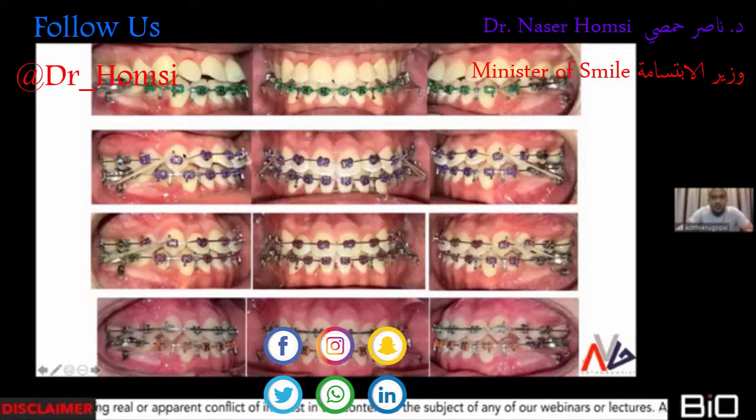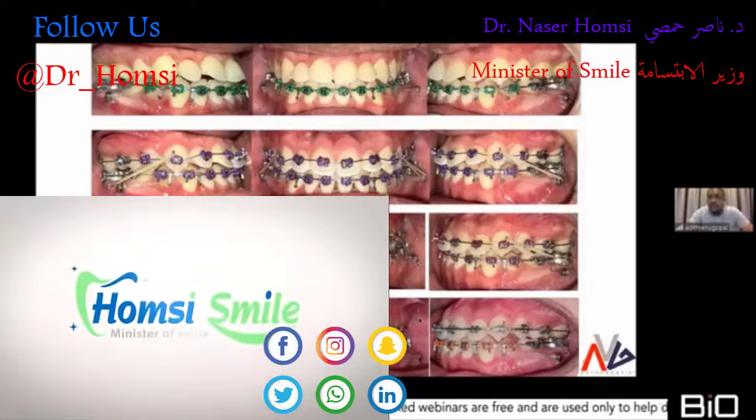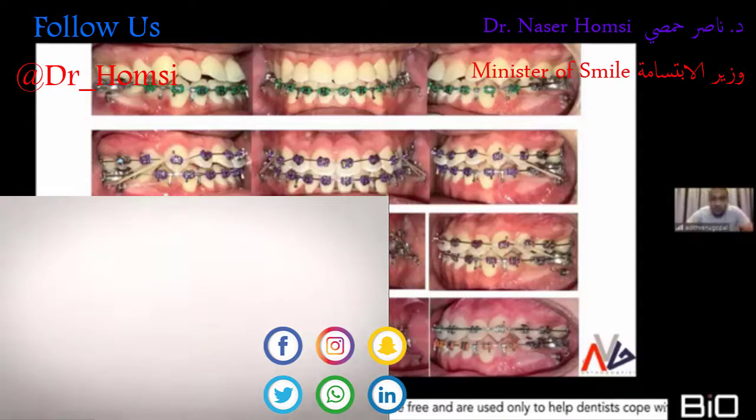If I would have used the elastics from the upper canines onto the lower molars, it would have proclined the lower incisors forward again, which I didn't want. So I continued the distalization, and at the same time, I started tipping the upper teeth back, as you can see. Now, this is the stage where I jumped into rectangular wires, and here it's on a 19 by 25 stainless steel, and you can see that I've gained a good amount of control.